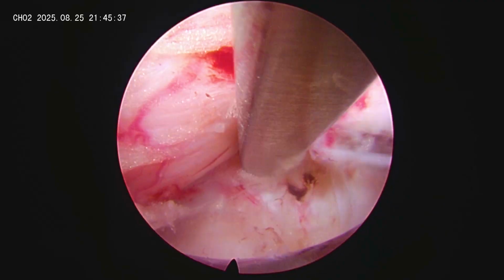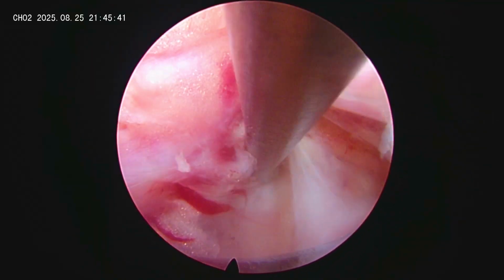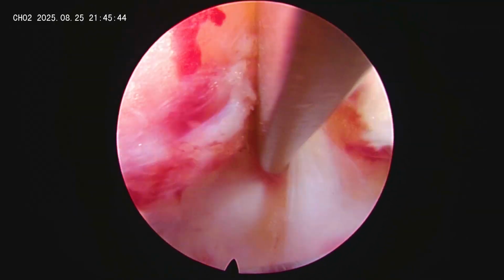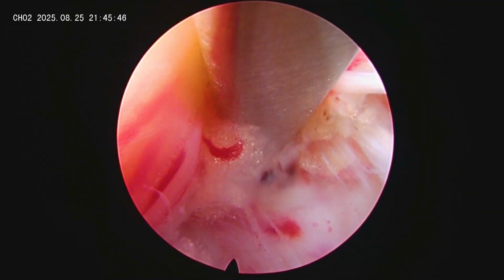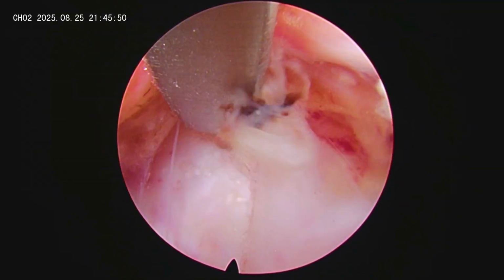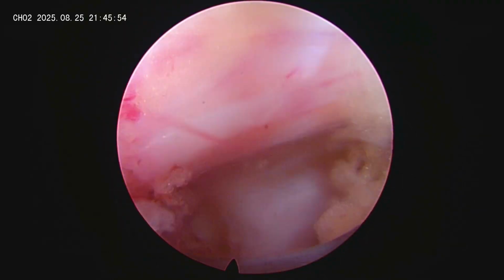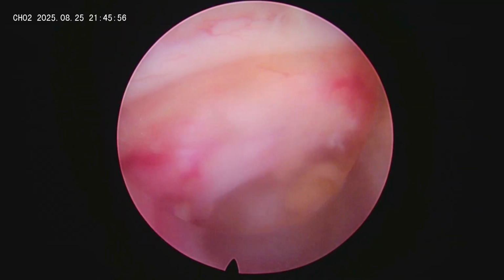So one more unusual thing in this patient is, you can see here there is a big epidural vessel just lateral to the traversing nerve root. Actually it was underneath the traversing nerve root. Once I decompressed that area, the root shifted medially. So you can see here there is a big vessel lying just lateral to the traversing nerve root.